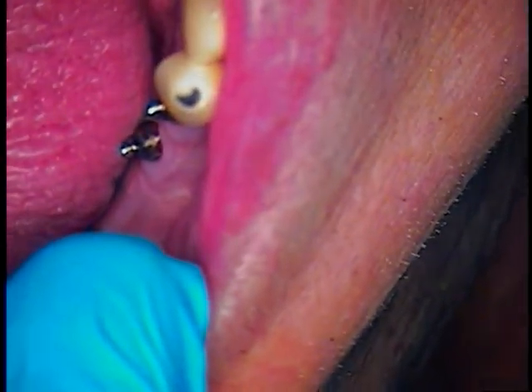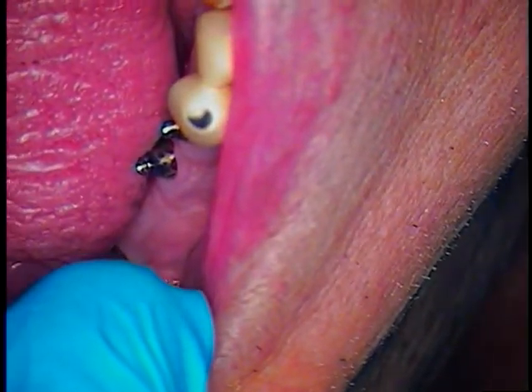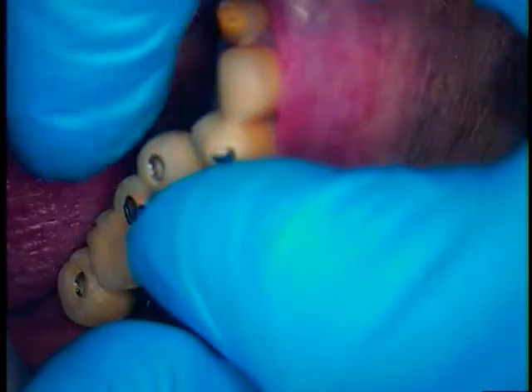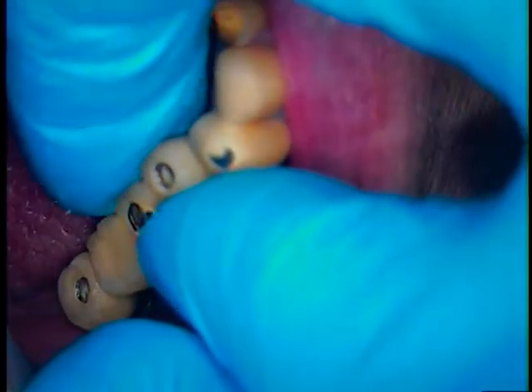We've got some more prosthetic screws. Let's get the bridge out and see if the bridge drops in in this position. It's going to seat passively — we're looking for a passive fit, no rocking. Let's see if things go back. If we're lucky, great; if not, then we've got to move things around. It looks like we're going to have to move it around.